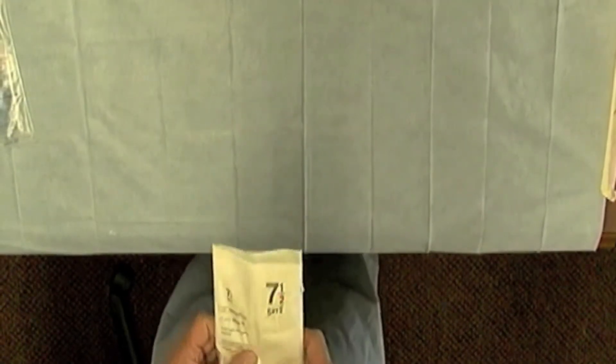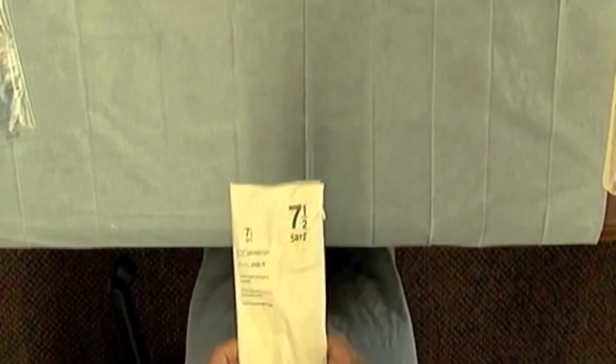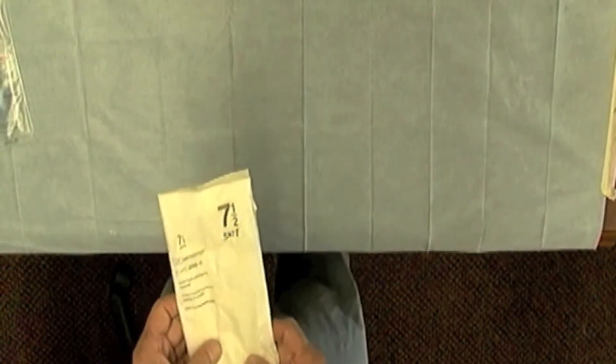I'm now demonstrating the open gloving technique. Generally, when you do open gloving, your field on which you're putting your glove pack is not sterile.